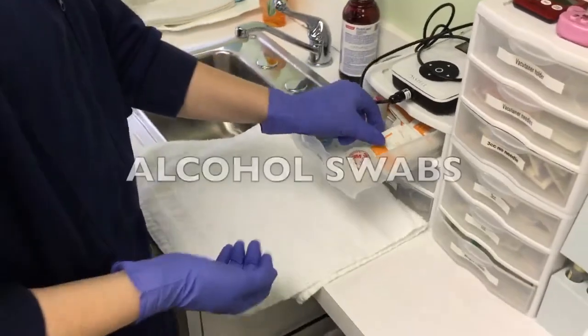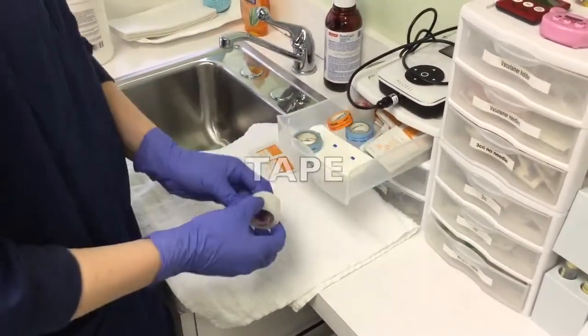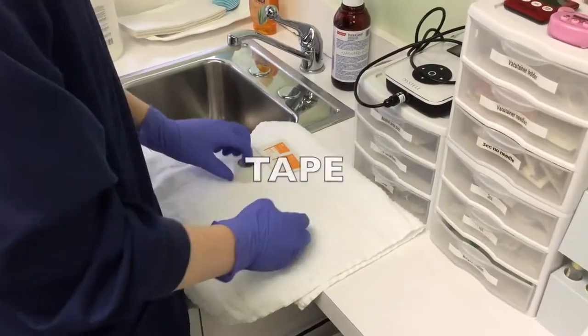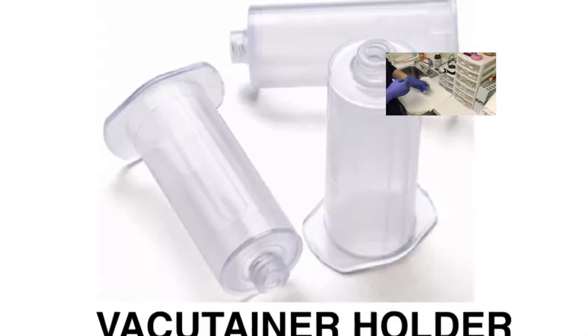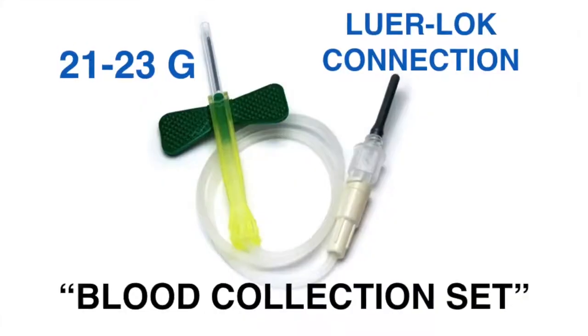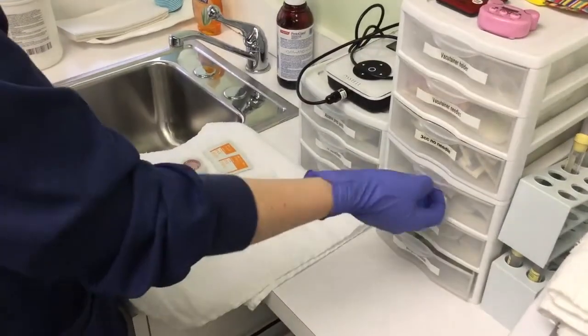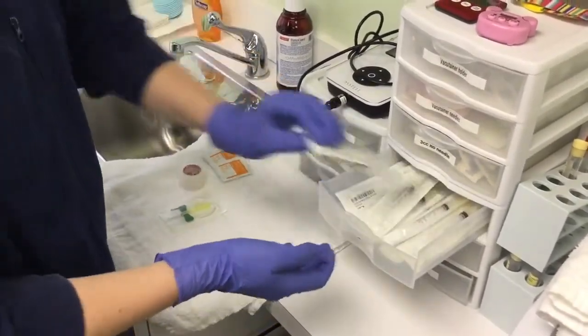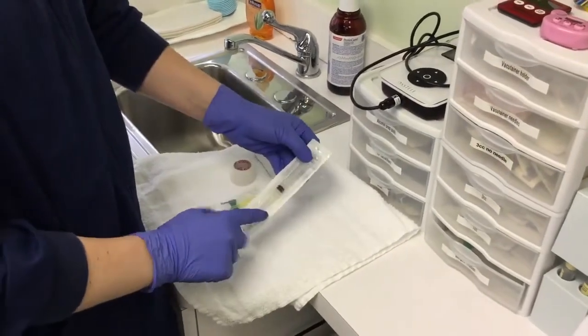For this we need two alcohol prep pads, the roll of tape, a vacu-tainer, an arm holder, as well as the vacu-tainer needle, and a 3cc syringe with needle.